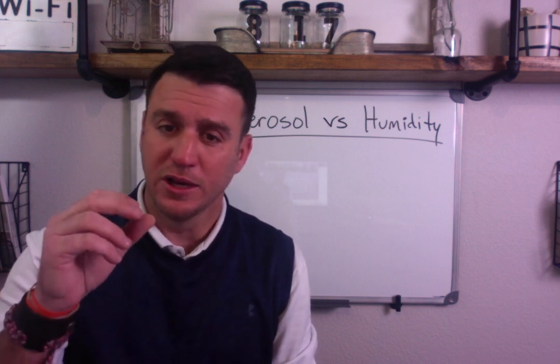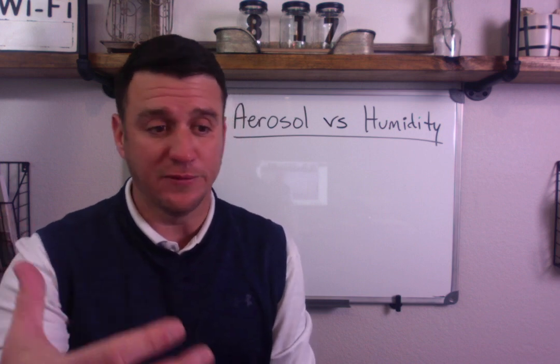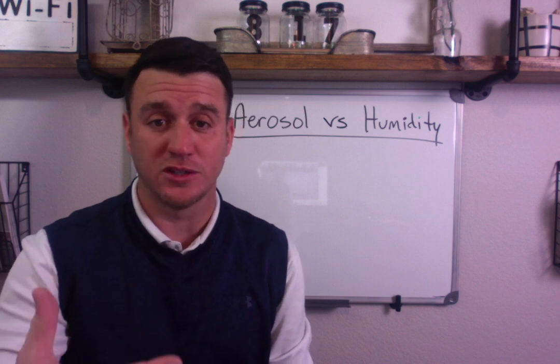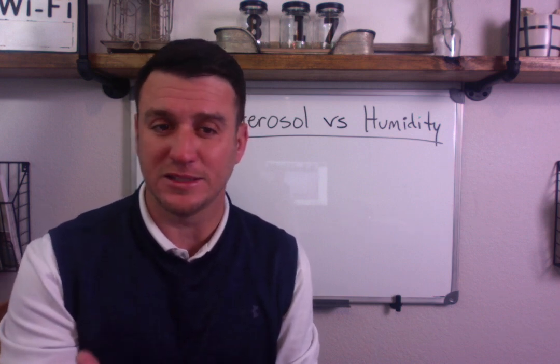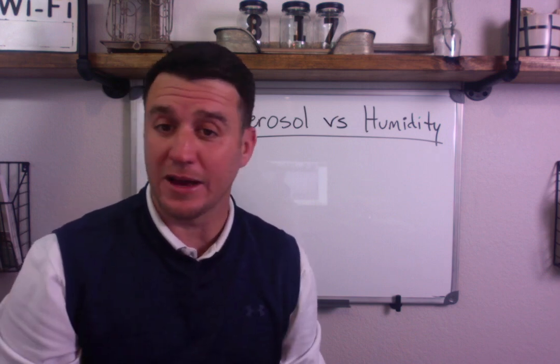She wants to maybe review this stuff, or maybe even if Tay's a first semester or a second semester student, maybe just sharpen up her skills on understanding the differences between these devices. When would you use one versus another? So that's what we're going to break down here today.